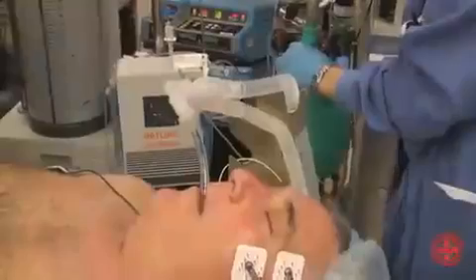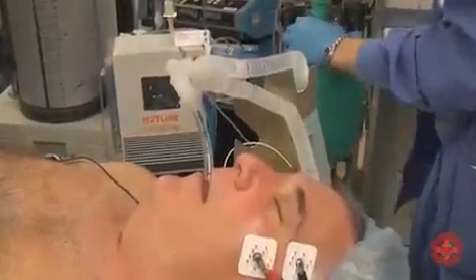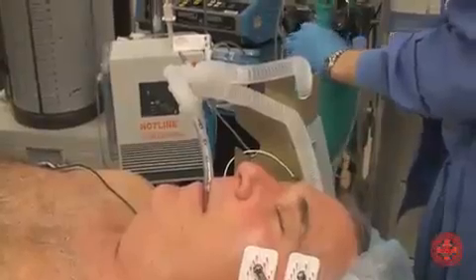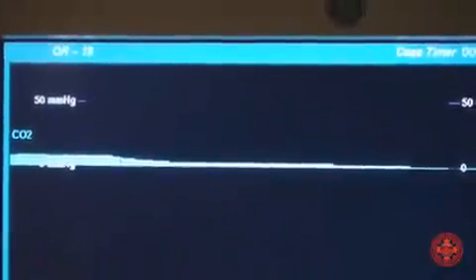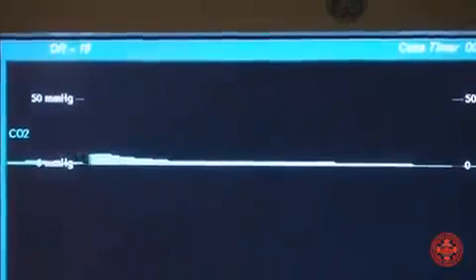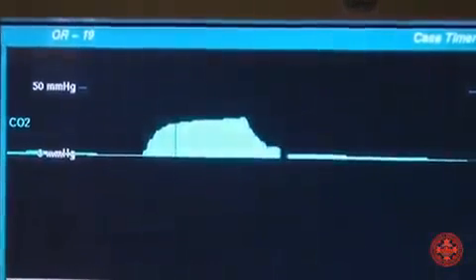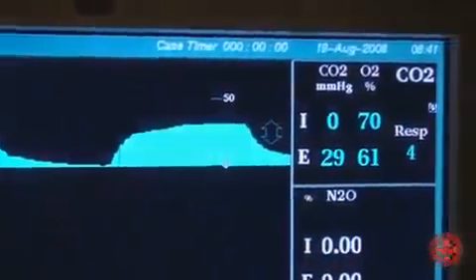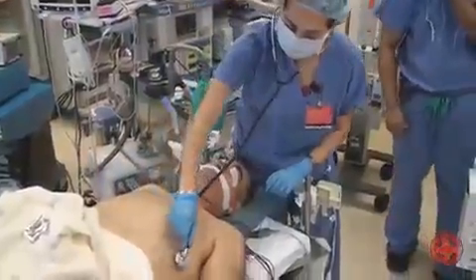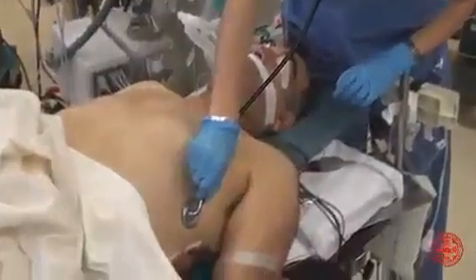If the tube is in the trachea, ventilation attempts usually result in visible condensation in the tube and chest wall movement. The best indication that the patient is being properly ventilated is the detection of carbon dioxide by the capnogram. However, this method alone does not reliably determine if the endotracheal tube is in the correct position. This is because a capnogram tracing would appear even if the tube were in a mainstem bronchus or in the oropharynx. Another means to corroborate proper tube placement is chest auscultation.